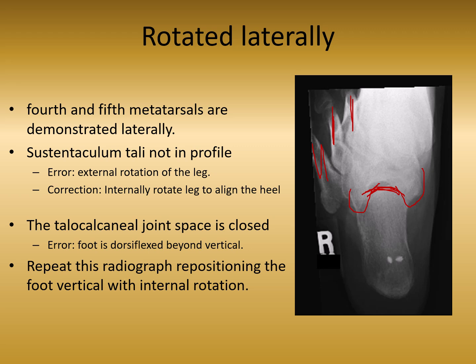So this one definitely what we need to do is relax the dorsiflexion of the foot so the plantar surface is perpendicular to the IR, right? Bring the foot so it's vertical, and then double checking our angulation that we're only angling 40 degrees. So just checking that angulation and the proper position of the foot.